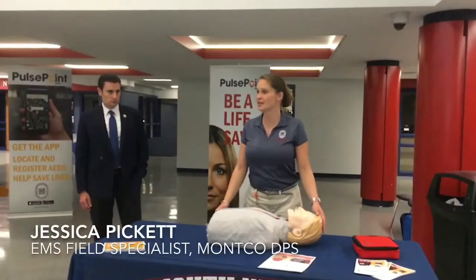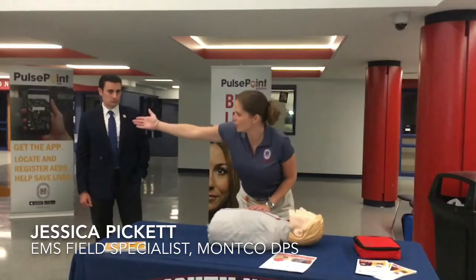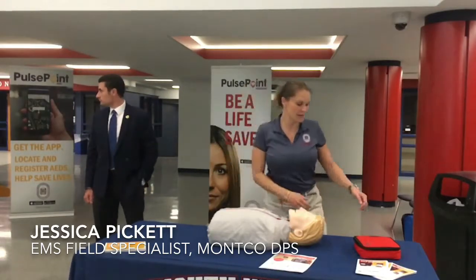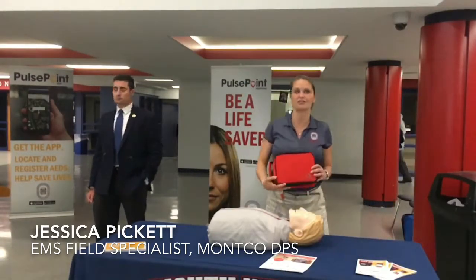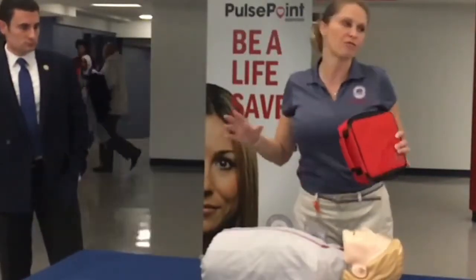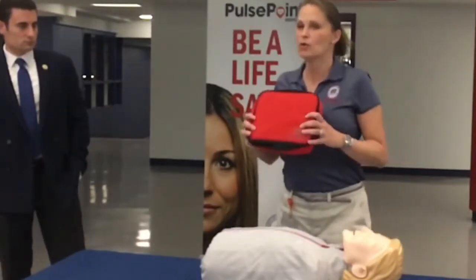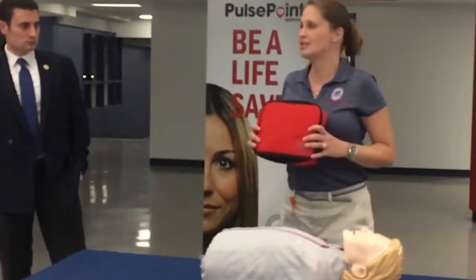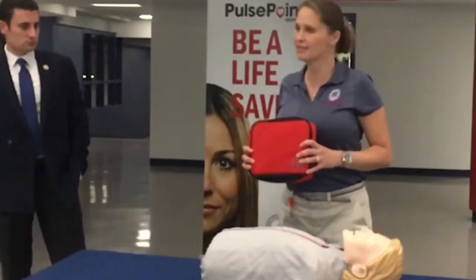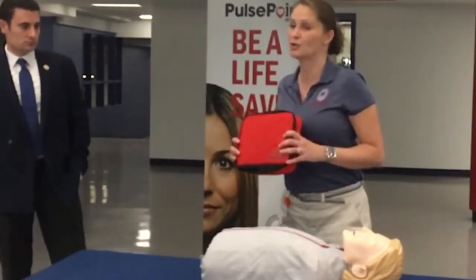I'm here to give you a demonstration of what exactly an AED is. We can see there's an AED on the wall right over here, and we have another AED — this is actually a trainer. AEDs come in all different shapes and sizes, but they all perform the same function. If you put an AED on a patient, it will determine whether or not that patient needs a shock. You don't have to be afraid of it — they speak to you, give you instructions, and tell you what to do.